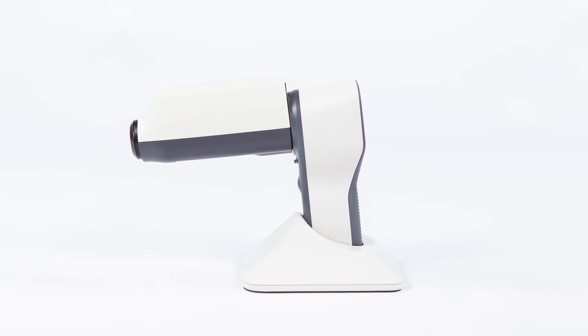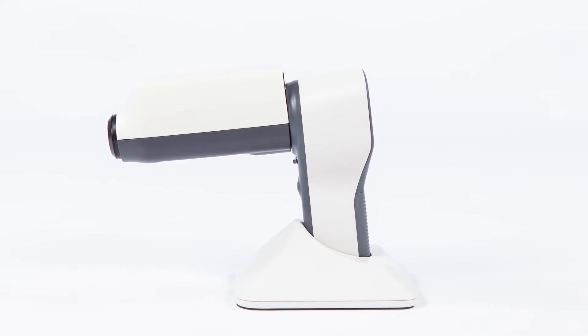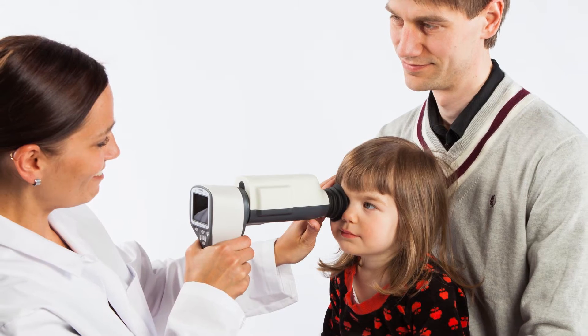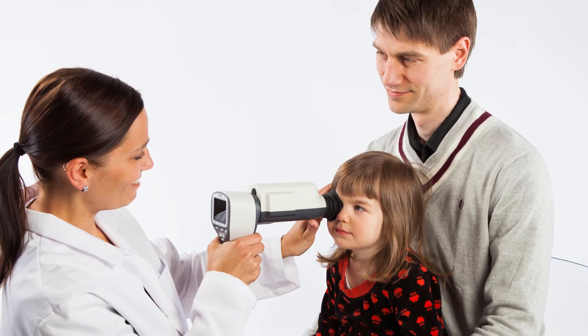SmartScript Pro is the leading portable fundus camera in the market. It enables non-mydriatic fundus imaging and documentation of patient data through digital images and video. Let's go through the steps for achieving optimal image quality during a fundus examination.